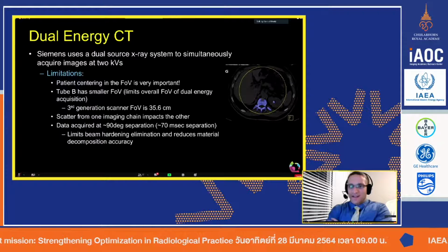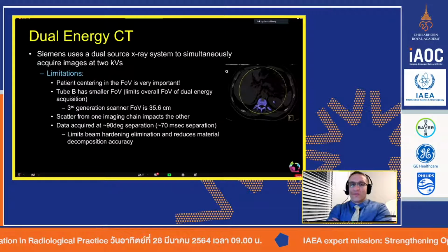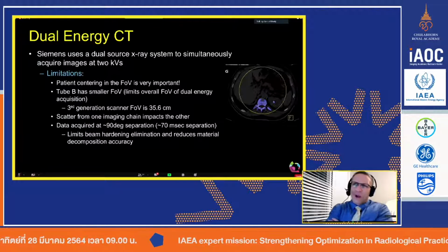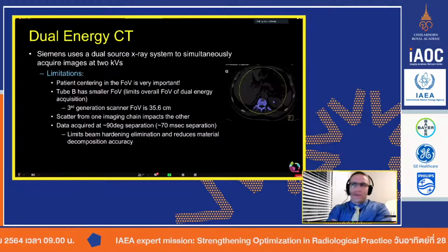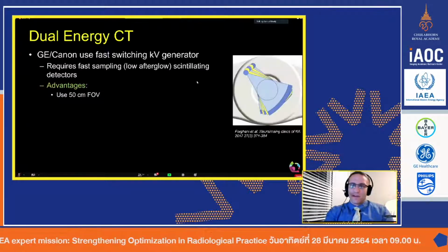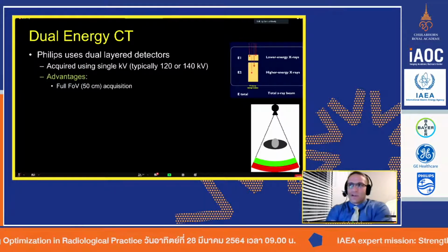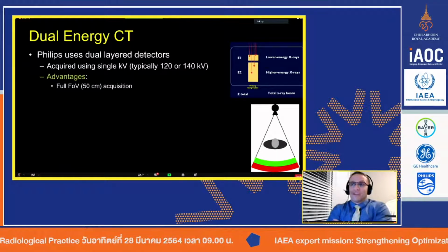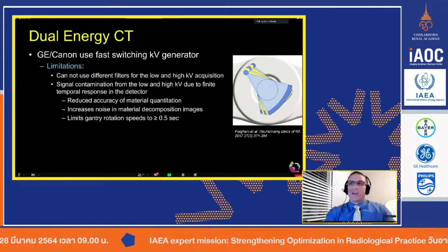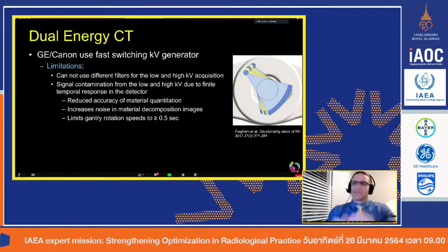Yep, it is. And so, like I said, it really depends on the type of scanner you get. If you are someone that thinks dual energy is really the future, but you don't quite know how you're going to use dual energy on every one of your patients, then this scanner is probably not the best scanner to have. It might be the Philips scanner, this one, because this one you can do dual energy on every patient and you can just turn it on and off whenever you want. If you do know exactly why you're going to use dual energy, but your patient population is larger, then this might be the scanner you need.